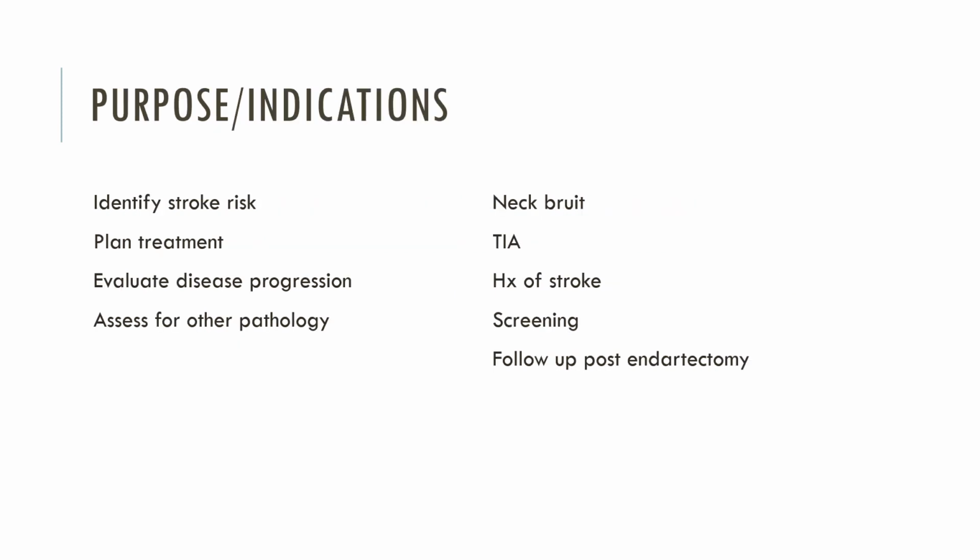So now we'll take a look at the purpose or the indications for a carotid scan. First of all, one of the purposes is to identify stroke risk by looking at the amount of plaque and stenotic change that a patient may have in their carotid arteries. Secondly, it can be utilized to plan treatment.